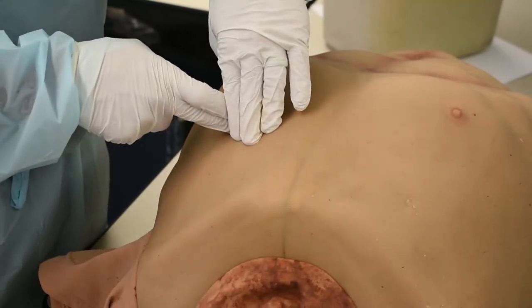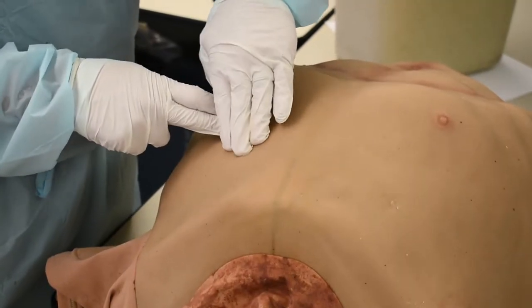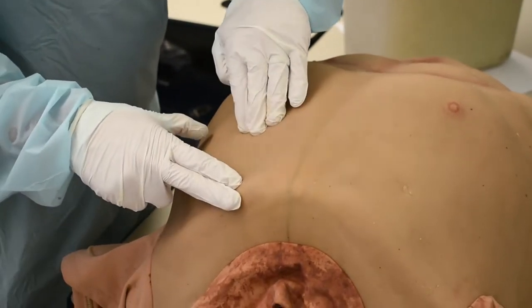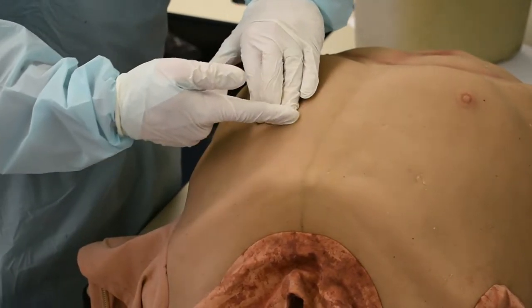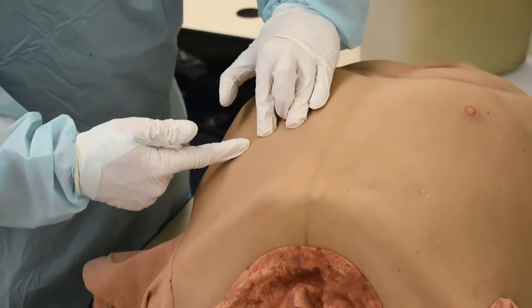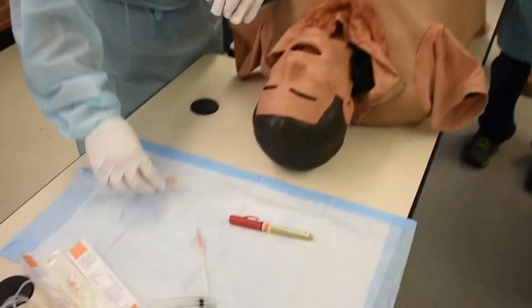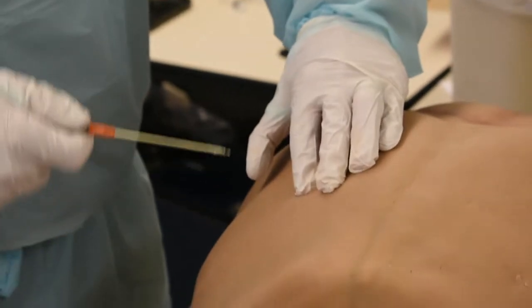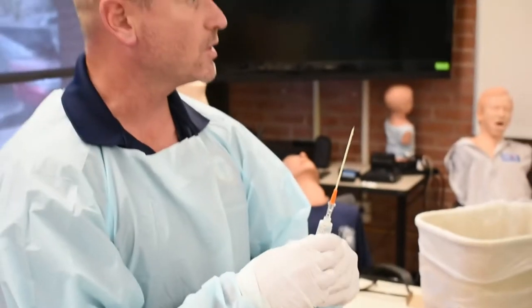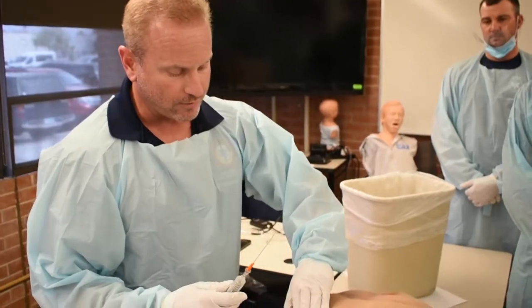I need to be at second or third intercostal space. You have two options, and it doesn't matter which one you do. I found his rib. I'm going to pull the skin down because we always need to be on top of the rib with our needle. We have our neurovascular bundle — our artery, veins, and nerves — that run underneath that rib. These 14s and 12s have ginormous bevels on them. I would not want to be under the patient's rib and have my needle transect that artery, vein, or nerve — I could take a pneumo and put them into a hemopneumothorax.